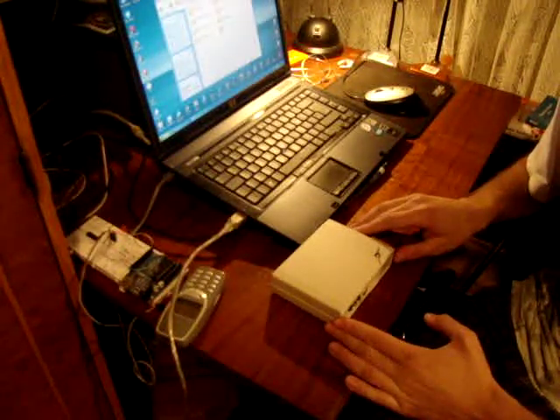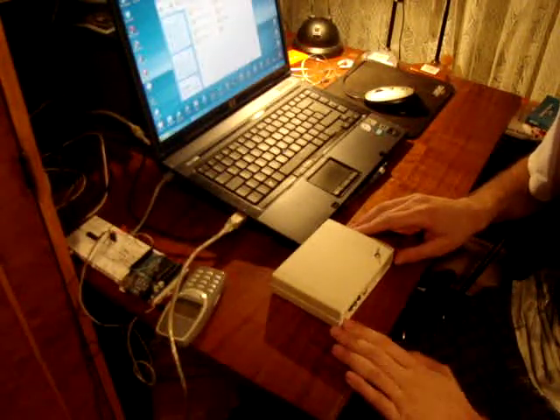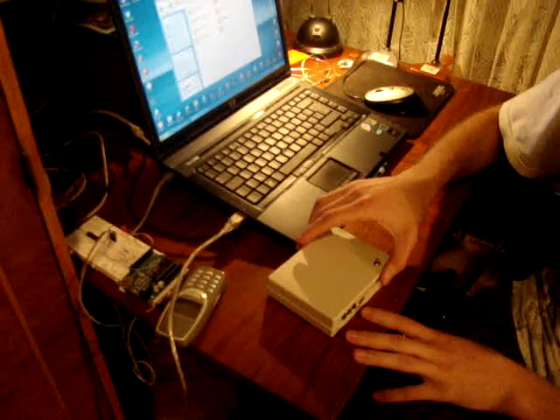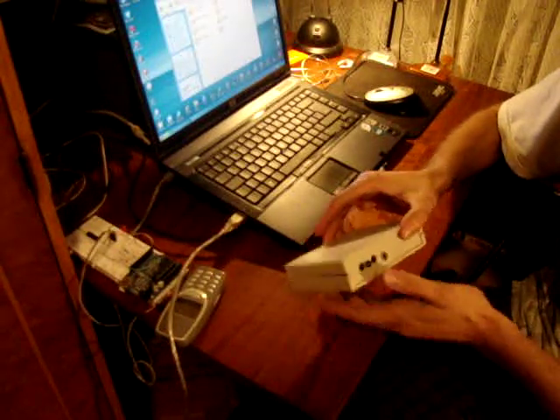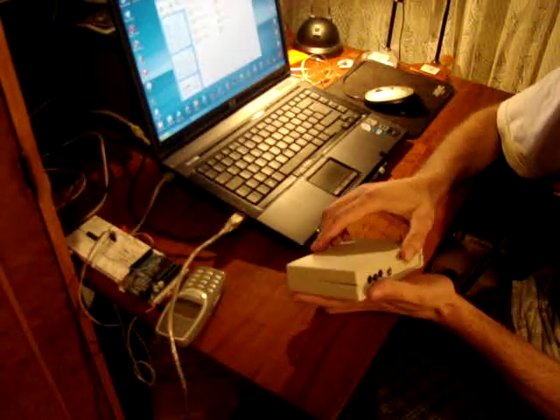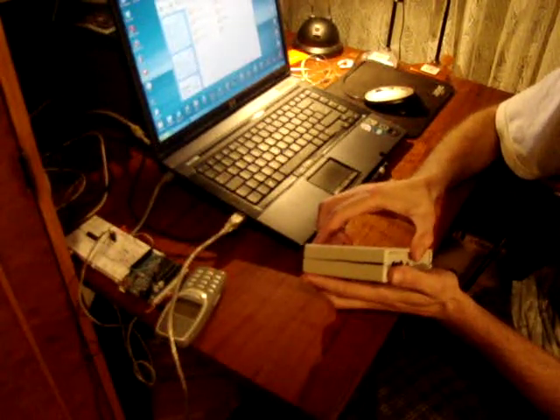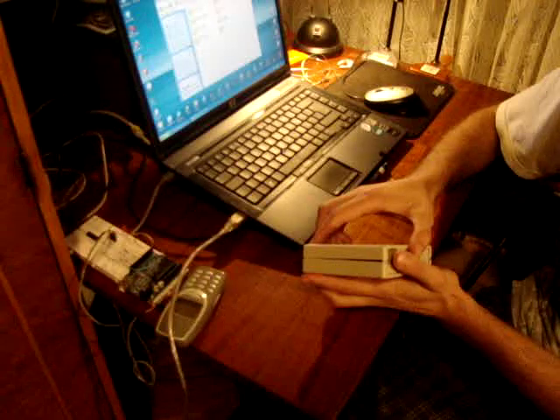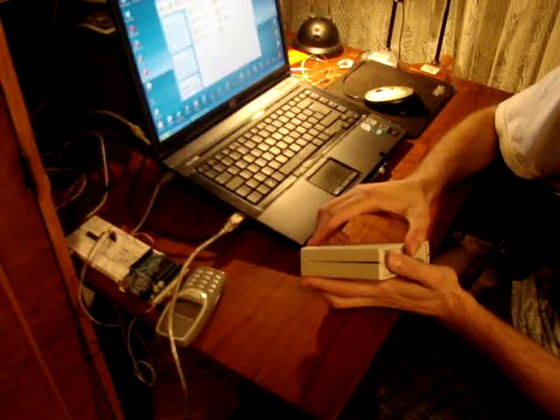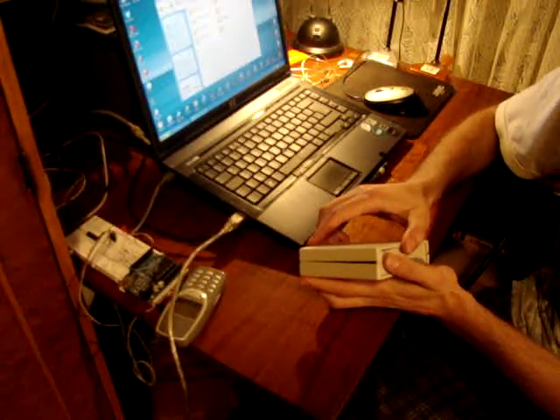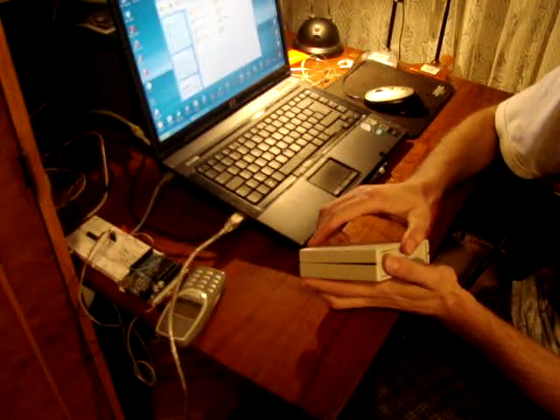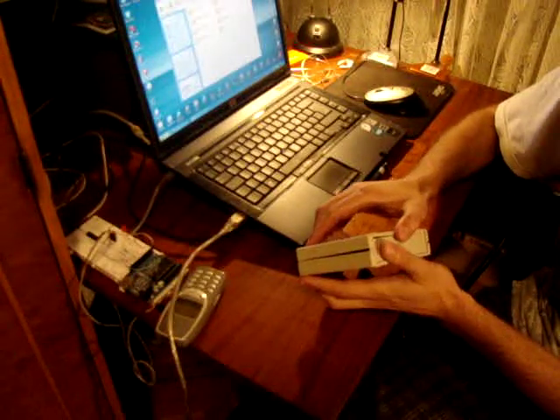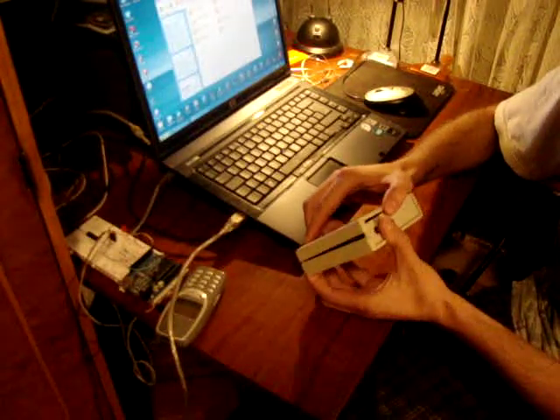This is basically a system that detects whether or not you're under stress and gives up a reading on the computer.